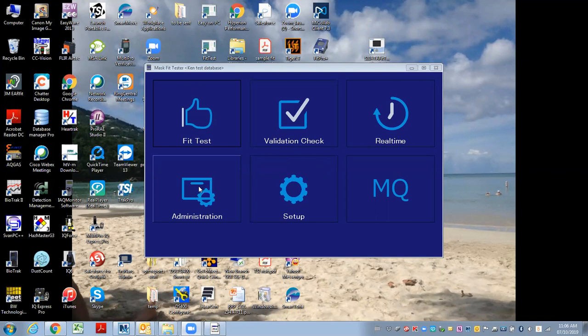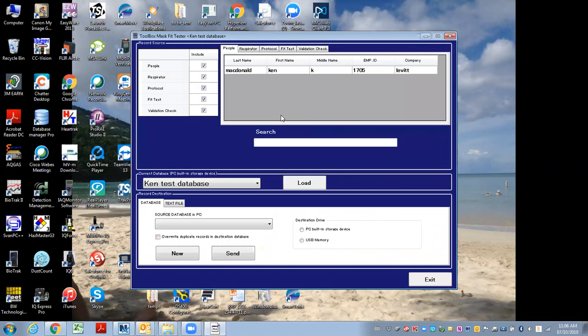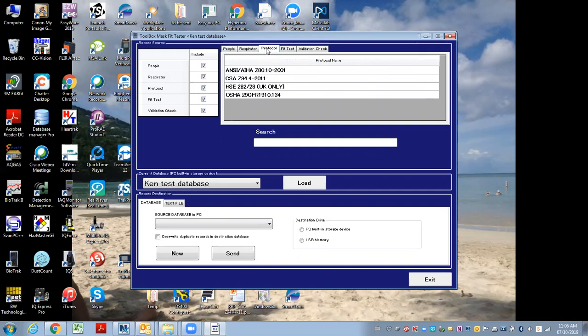I'll show you how to do that if we go under Administration and Toolbox. I'm working in this test database, and these are all the different fields and data that are available. I can click through and see that I've got some respirators and some fit tests.